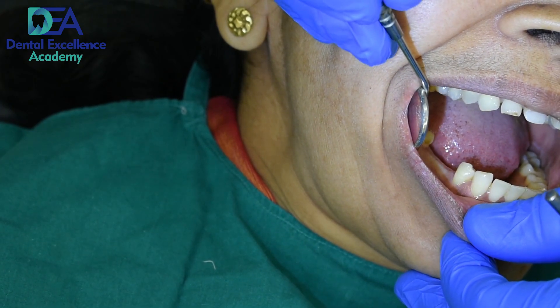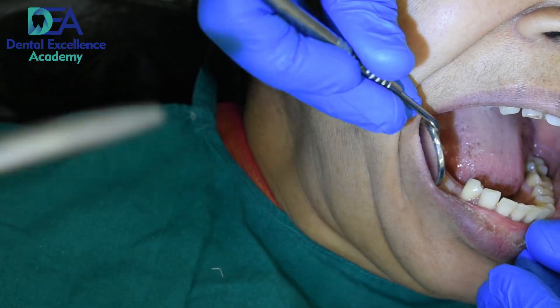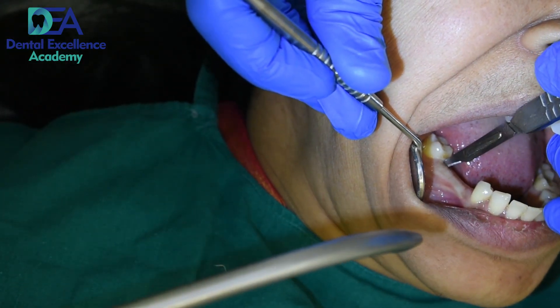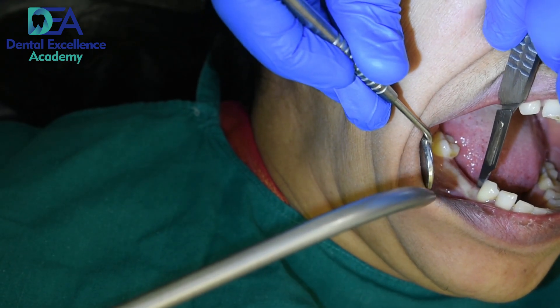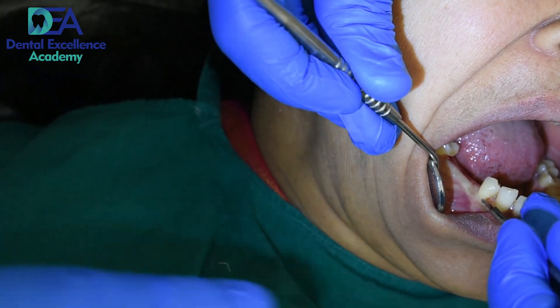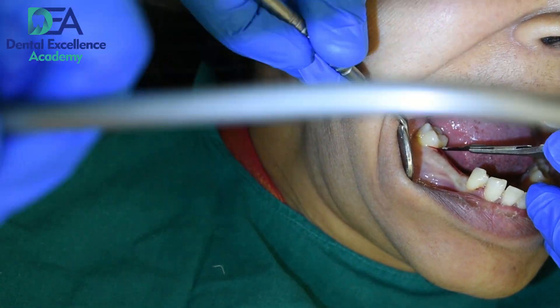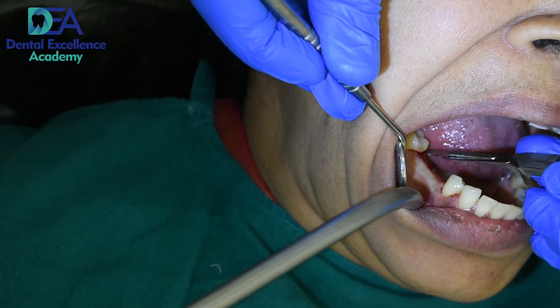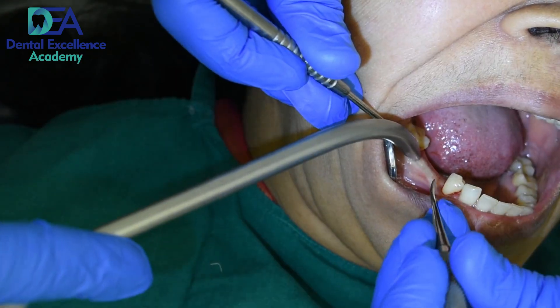We have already injected the patient. Now I am starting with the crestal incision. Now this is the crevicular incision.